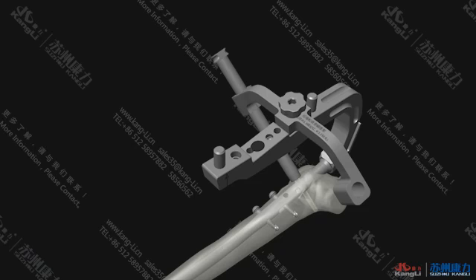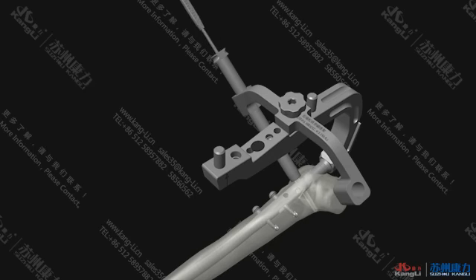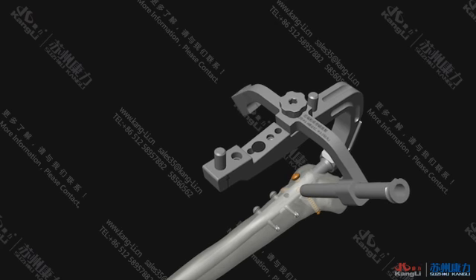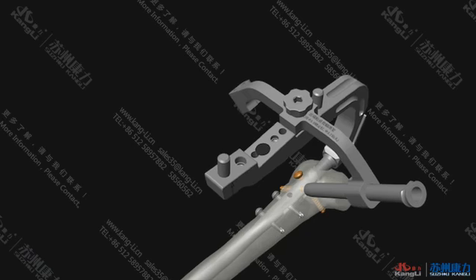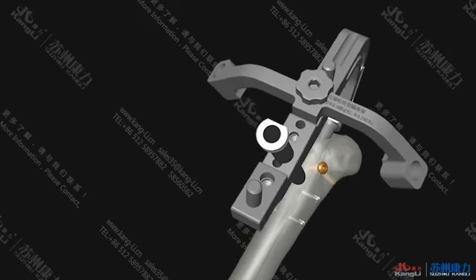Keep the outer sleeve closely contacted with the bone cortex and insert the guide depth gauge to measure the diameter of the bone. Choose the phi 5.0 locking screw with appropriate length and screw it in with the 3.5 hexagonal screwdriver. Repeat the above steps to finish the placement of the second and the third phi 5.0 locking screws for the oblique as well as the front and rear positions respectively.